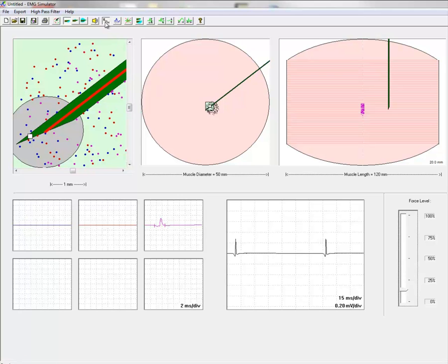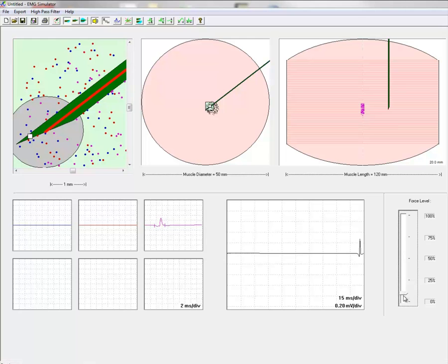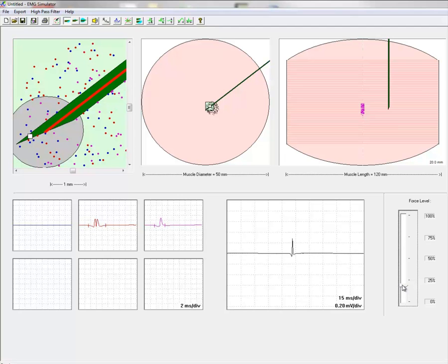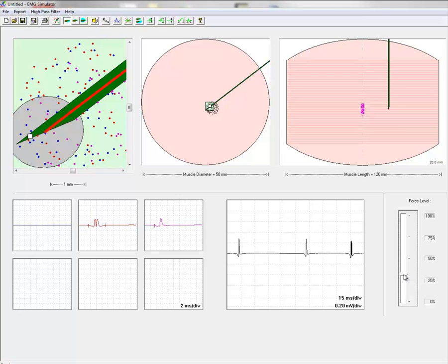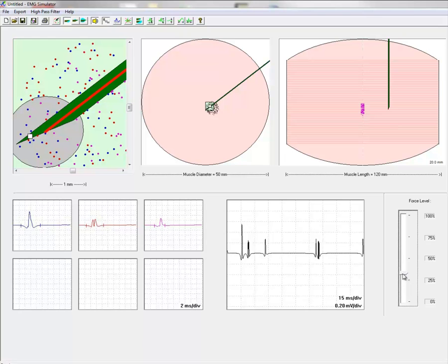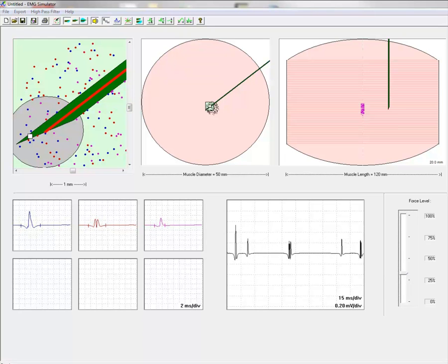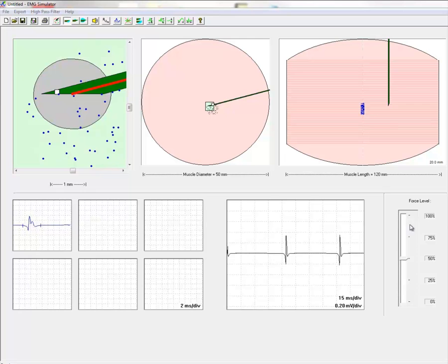Three motor units are given 5, 15, and 30 percent firing threshold. Here is below firing rate and it increases with slightly more activity. Then the next motor unit is starting with low frequency and then the third one is coming in and all three motor units are active. The one with the lowest threshold is going with the highest frequency.